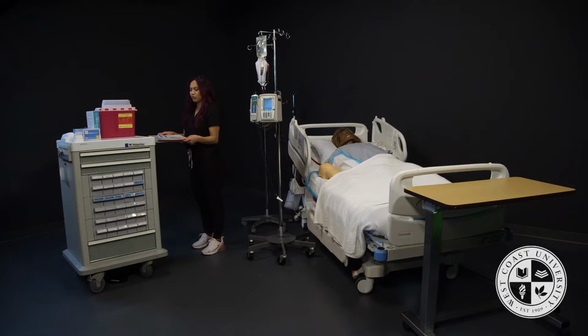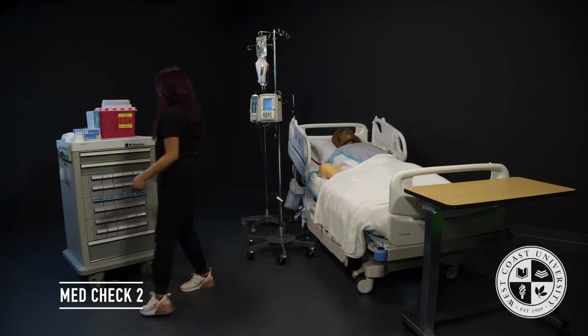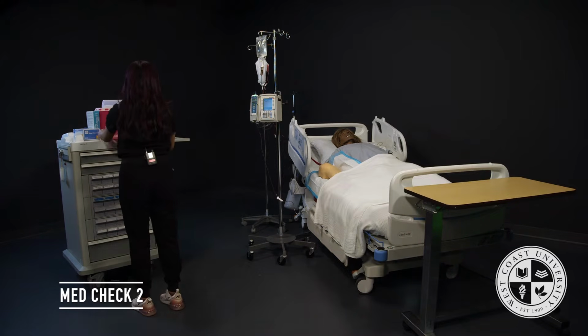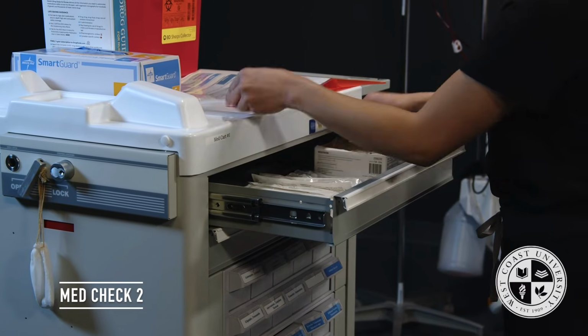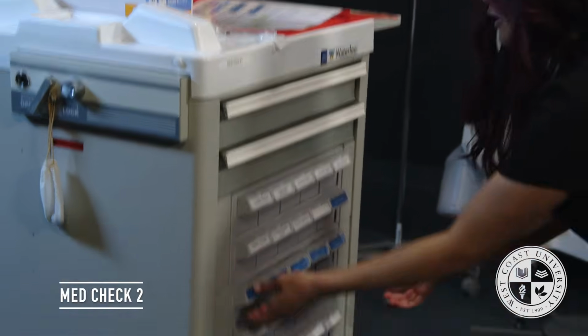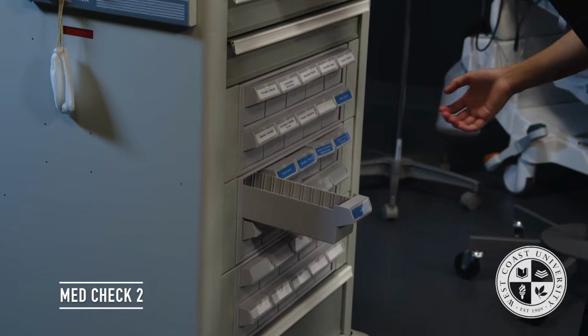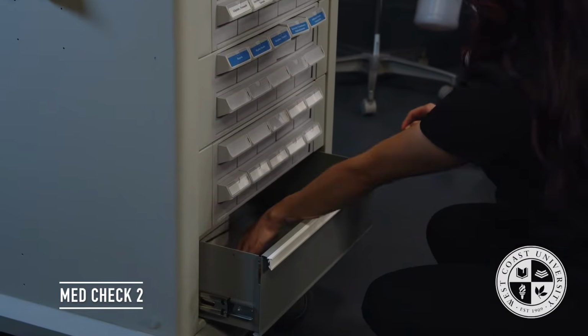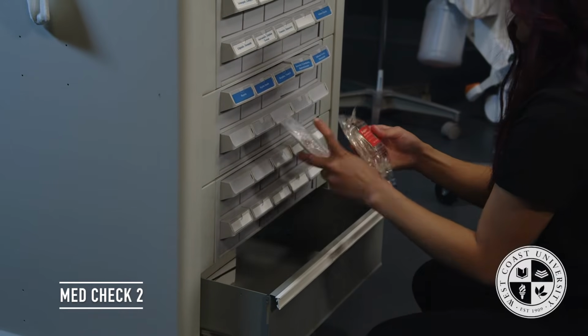My MedCheck 2 will start by me pulling my medications from my med cart. So I'm going to go over here, grab my medications. I know that I'm going to be needing a needle for my subcutaneous heparin. I'm going to need some alcohol swabs. I'm going to go down here and grab my heparin dose. And right over here, I'm going to grab my IV piggyback medication and the tubing.